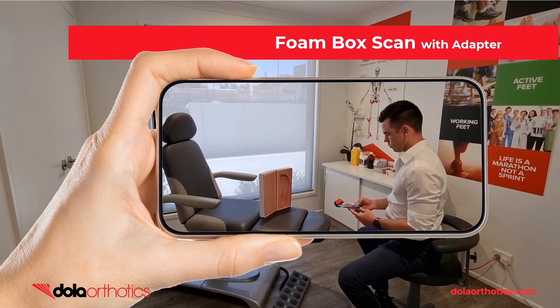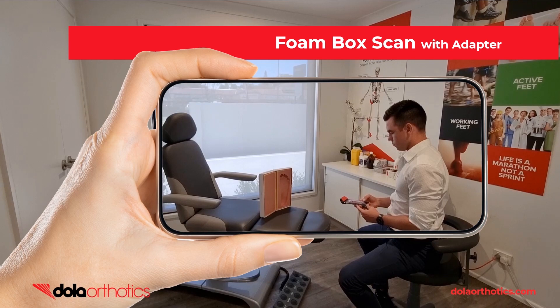Here is a demonstration of the iPhone with Dollar iScan adapter being used to capture a foam box foot impression. The adapter provides easier visualization of the screen during the scanning process.